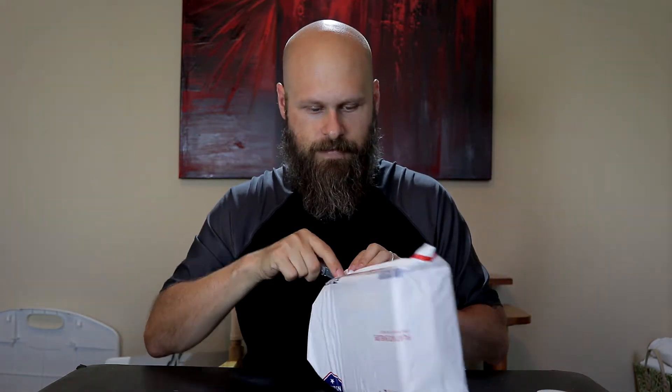I asked would he be willing to send me one so I can take a look at it and possibly make a video letting everybody know what they have. And sure enough, he was very excited about that idea and sent this out to me. Now they've got a couple different devices and I'm not entirely sure what he sent me. I believe he's going to send me a couple of things, so I'm excited to find out what's actually in here.